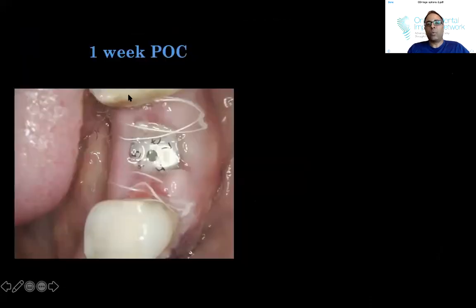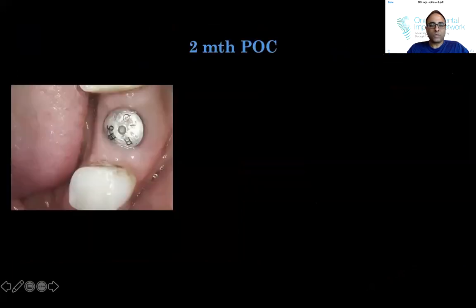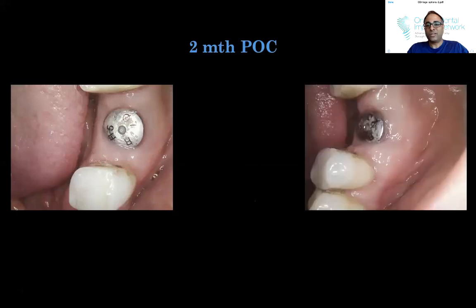And then this is the 1 week post-op, which I encourage you all to get, which is generally a nice photo. We want to make sure that we take photos of our surgeries to be able to document how things are going. And then ultimately we have our 3 week check, and then we have our 2 month post-op check. Okay, and things are looking really, really nice, and I haven't seen her since.